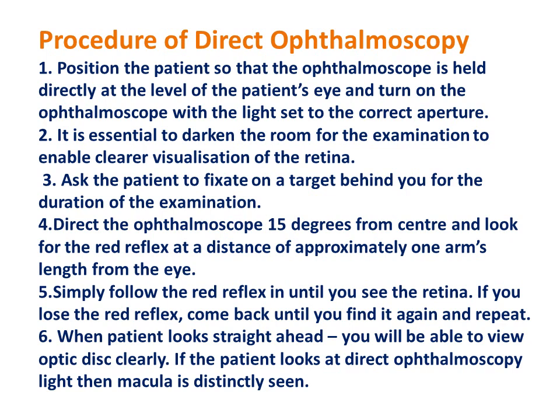It is essential to darken the room for the examination to enable clearer visualization of the retina. If the room is very dark, you can easily visualize the posterior segment much more clearly than when the room is very bright. Ask the patient to fixate on a target behind you for the duration of the examination. We normally ask the patient to look straight ahead. Especially if we are in a vision testing room, we ask the patient to look at the Snellen's chart straight away, because of this stability and fixation, we are able to assess the fundus much more clearly than when he keeps moving the eyes.